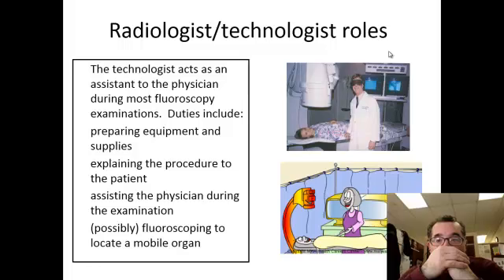In the past, when the physician would want a static image, so move away from that movie-like fluoro to a static image, we would have to pass them a cassette or put it into the fluoroscopic carriage, which would allow them to temporarily take a static view out of one of the fluoroscopic views. In other words, if they saw something that they wanted to capture, they could take basically a regular diagnostic x-ray utilizing a smaller size cassette than what we would normally use.